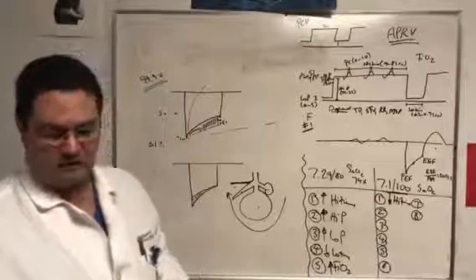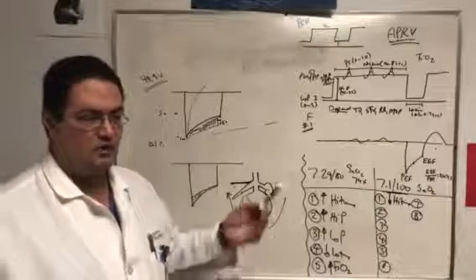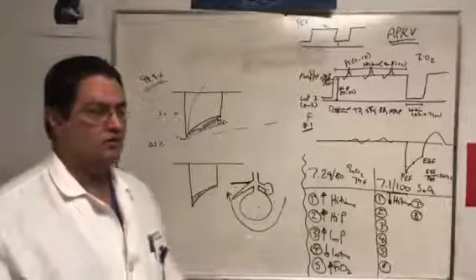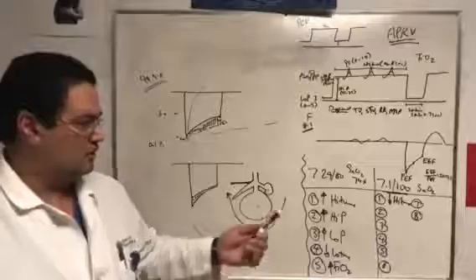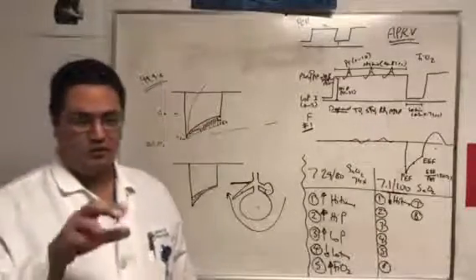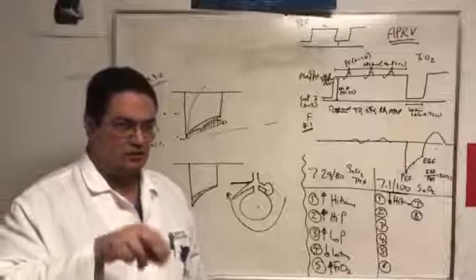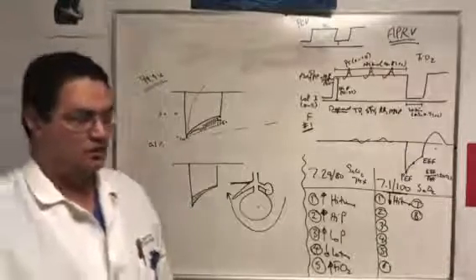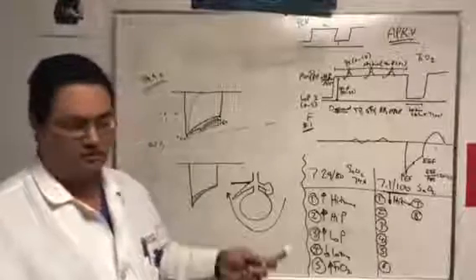If the high time is 6, you're gonna get about 9 breaths per minute. High time is let's say 4, you're gonna get probably 14, 13 breaths per minute, right? So that's the high time in classic APRV. I'm reminding you again, we're talking about classic APRV. We're not talking about the bi-level that we use every day. Okay, there's a big distinction, and I think that's the key to understand this stuff.